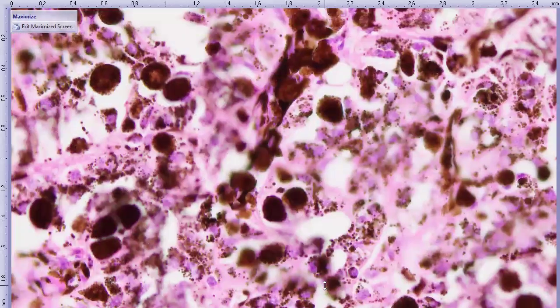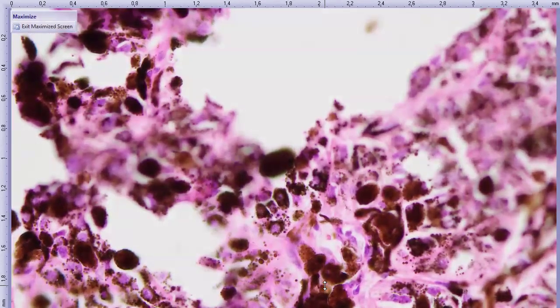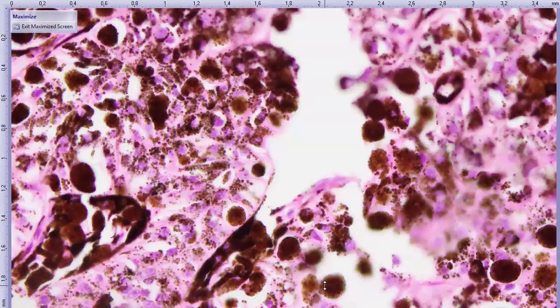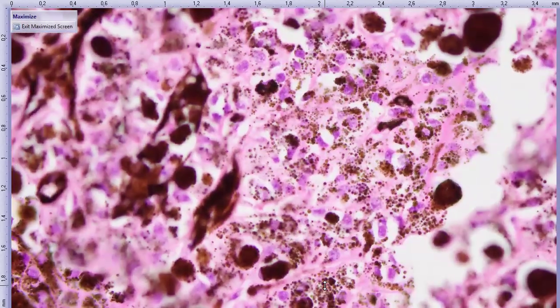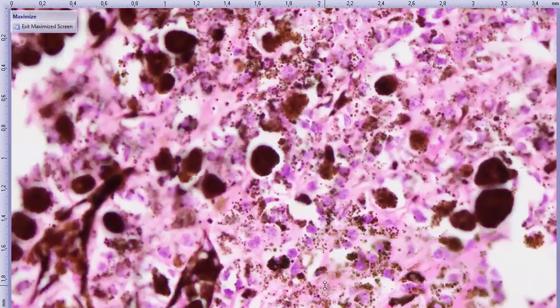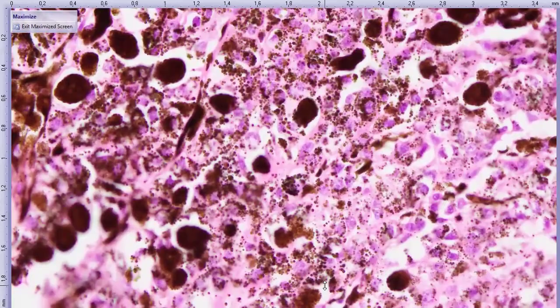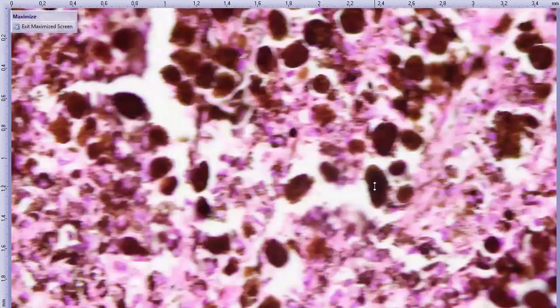The first thing one thinks when we say heavily pigmented melanocytic neoplastic population of cells in the eye is a melanoma. And I wouldn't argue against anyone that wanted to say that here. But when you look around, you start seeing that the cells in the background also keep some of that cord and trabecular-like appearance.